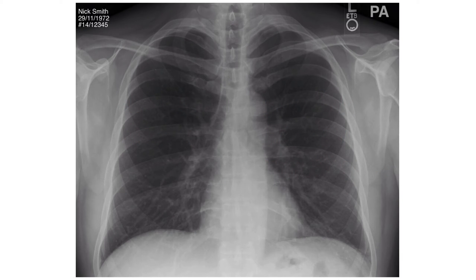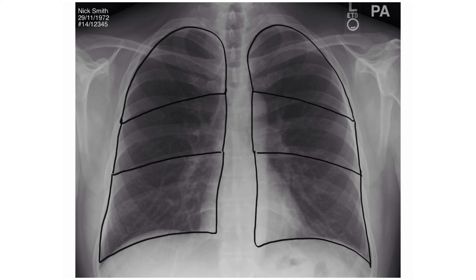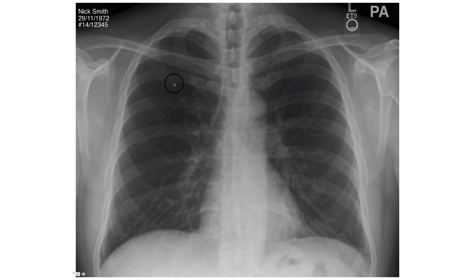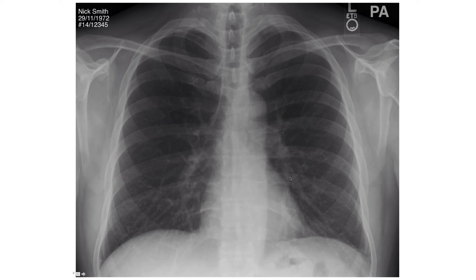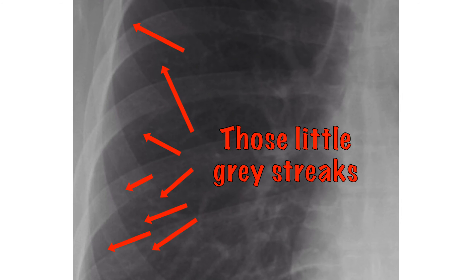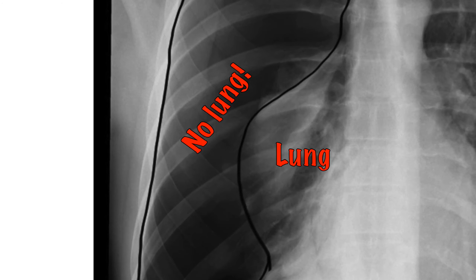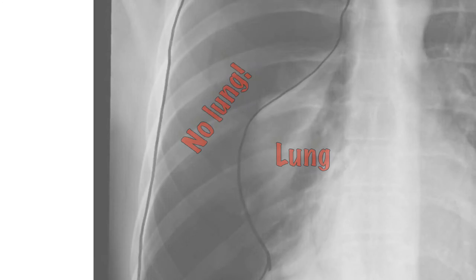When describing a chest x-ray, the lungs are divided into upper, middle and lower zones. Note this does not correlate with the lung lobes. Look at each of the lung zones in turn for symmetry and compare each zone with the opposite side. Do any areas look too black or too white? If so, decide which is the abnormal side. Make sure you can see lung markings going all the way to the edge of the chest wall. If you can see the lung edge with a black area surrounding it, suspect a pneumothorax. Note the pleura are not visible in healthy people.